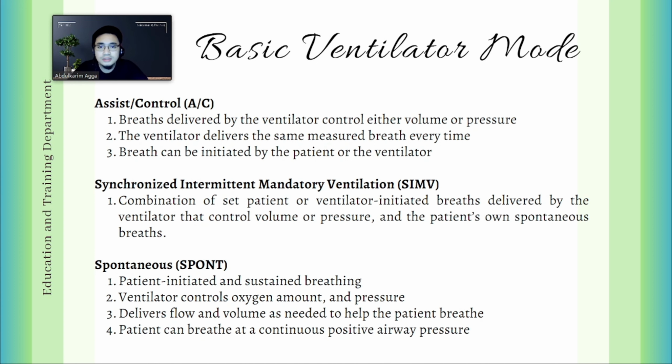So take note that these different settings are changed by the physician and the respiratory therapist depending on the patient's assessment or respiratory status. The process of decreasing the ventilator support or changing the ventilator mode is called the weaning process. So you need to remember this.